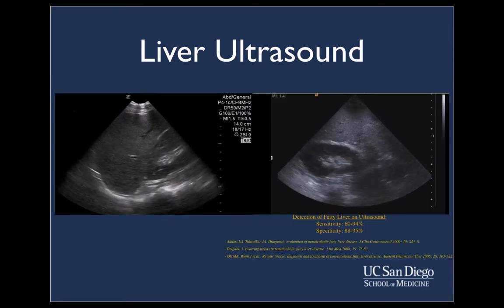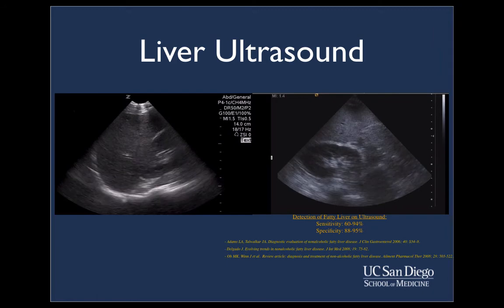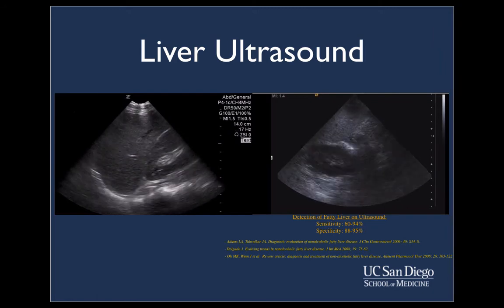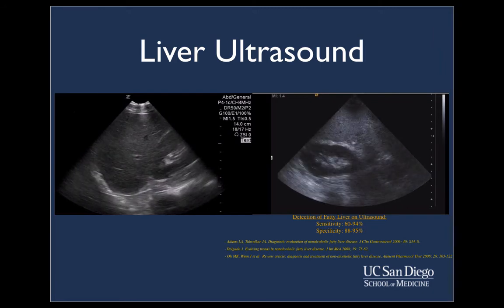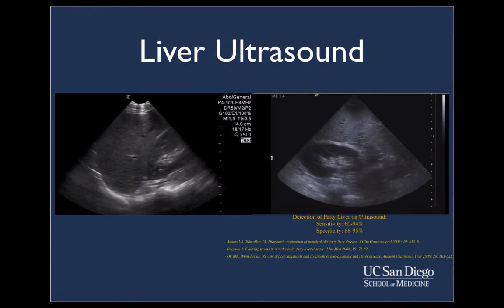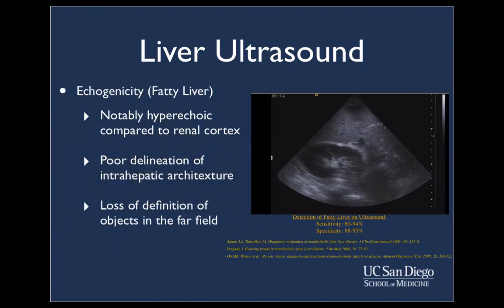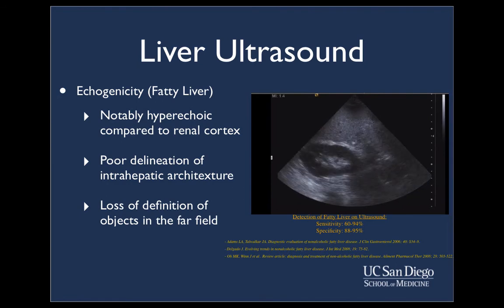Here, we can compare the normal-appearing liver on the left panel with an example of a patient with fatty liver disease on the right panel. Note the increased echogenicity of the liver in comparison to the right renal cortex. Additionally, the fatty liver makes it difficult to clearly delineate the intrahepatic vessels.